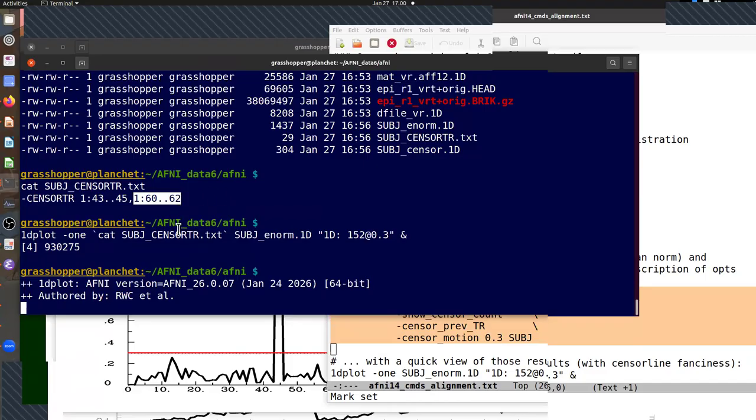It's kind of a syntax thing, and the programs are built to use that option, but I think that's the logic of it. Let's see, the new tool on distortion correction, is that the EPI B0, the reverse phase encoding one, Alexandra?